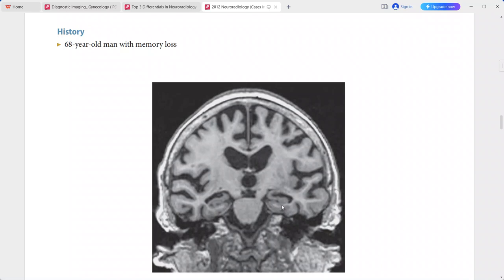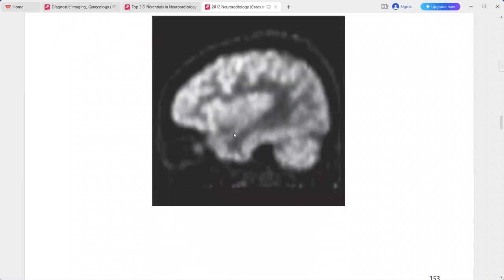The bilateral hippocampal atrophy is greater than the diffuse cerebral atrophy. The FDG PET scan shows relative hypometabolism in the posterior parietal and temporal lobes.